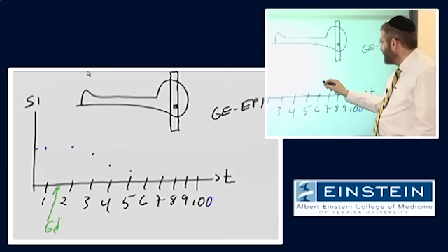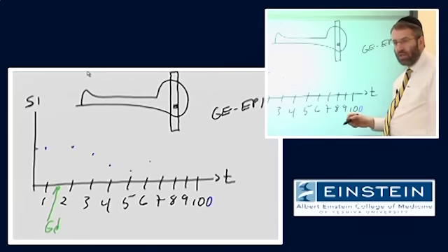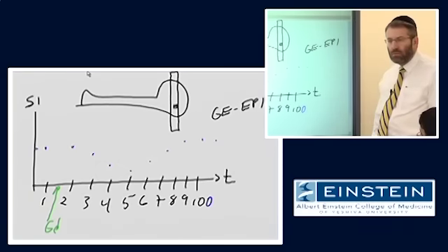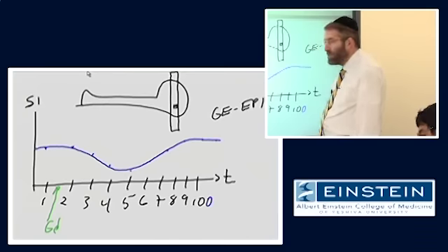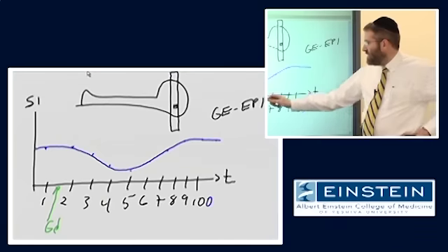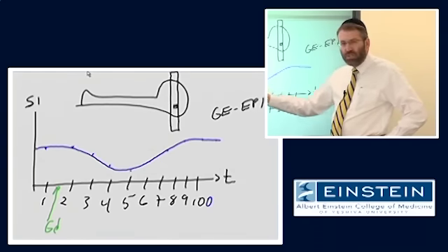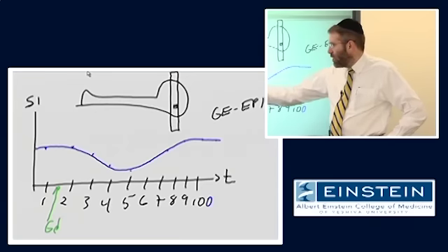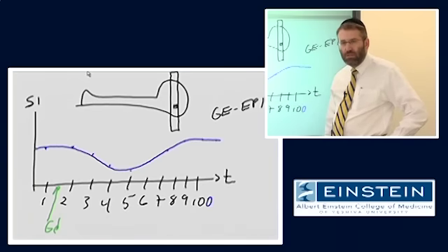And then as time goes on, the contrast bolus will wash through the tissue. The contrast concentration is declining at that point in time, and we will get back up to our baseline. So if we look at the trajectory of what's happening, we've shown that there is a decrease in signal, which corresponds to an increase in the concentration of the contrast agent that we can watch in real time. So we're essentially watching the first pass of a bolus of a contrast agent.